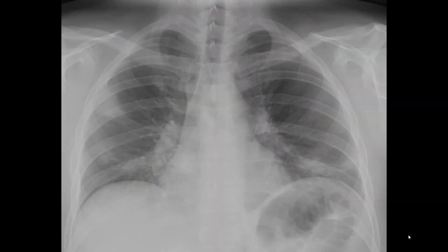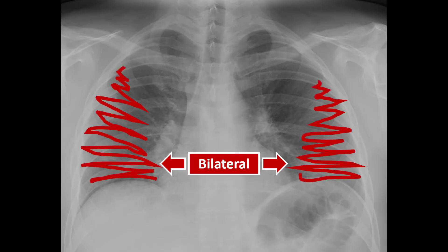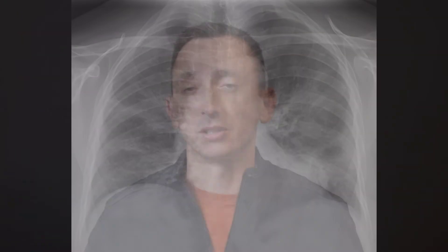Remember this: bilateral diffuse opacities, both interstitial infiltrates and signs of consolidation, most pronounced in the lower portions of the lungs and on the periphery just beneath the pleura, while the top portions are usually spared. You can see another example here — even better — bilateral, more or less symmetrical, worse in the bottom and the periphery.